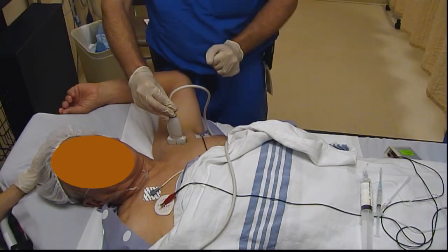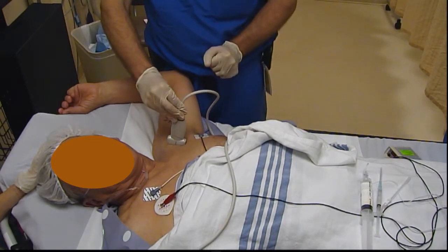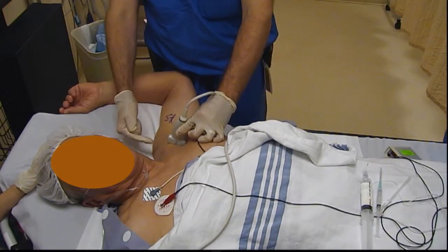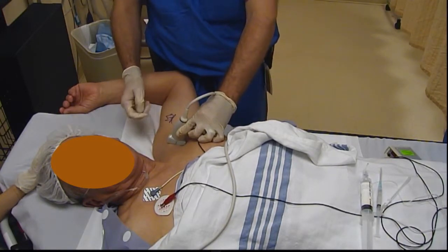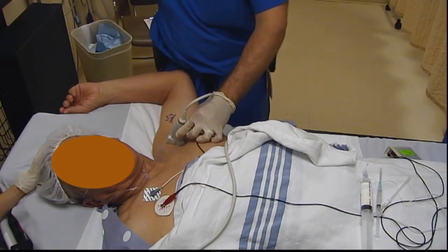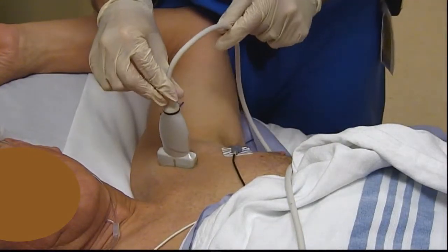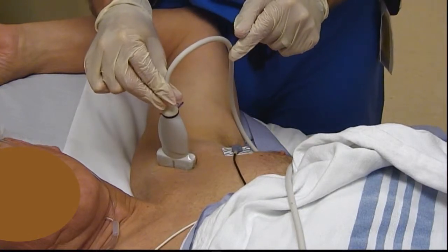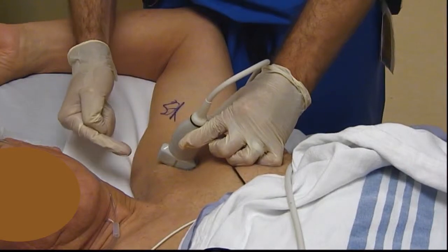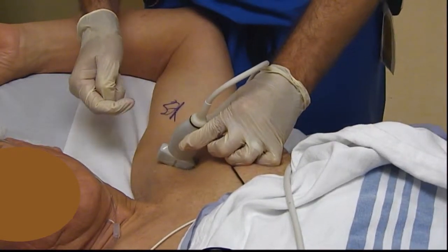The first of the important steps is a significant rock so that the probe is rocked back, rocking the beam back towards the needle insertion. That's going to help you pretty significantly when visualizing the needle as it's inserted. You can see that rocking motion a little better here — this is the plumb-bob perpendicular-to-skin position; rocking back towards where the needle's going to be inserted is really going to help you quite a bit with this procedure.